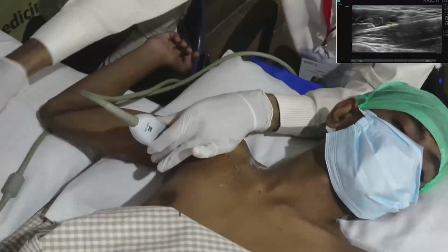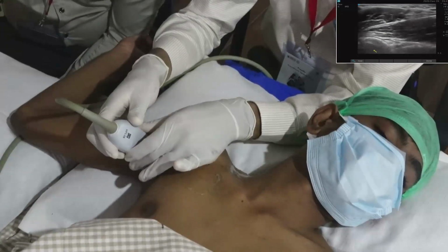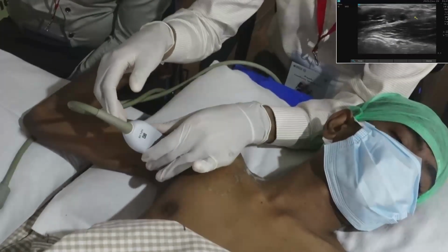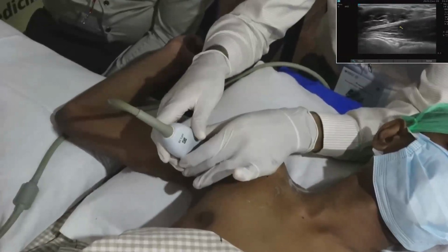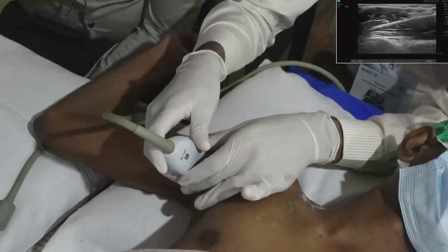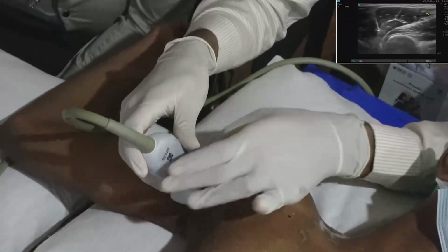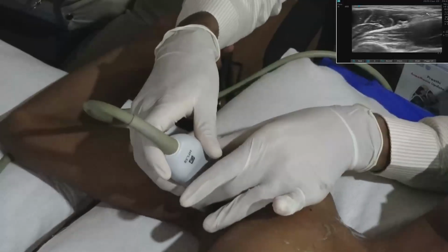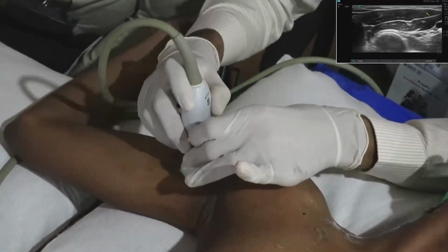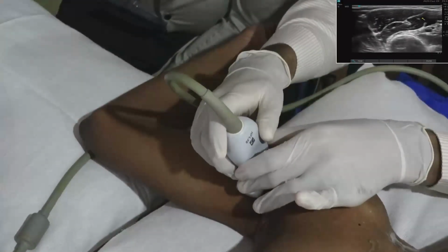So I will describe the anatomy. What we are seeing is the bony structure here, the humerus, humeral head, and conjoint tendon. The muscles being pointed out are latissimus dorsi and teres major. The pulsating structure is the axillary artery. Next, an easy identification of muscle component is the biceps. This is biceps, and the muscle below is coracobrachialis.